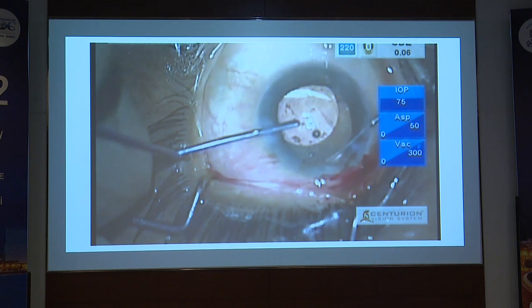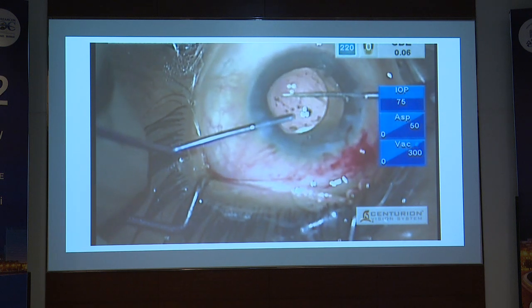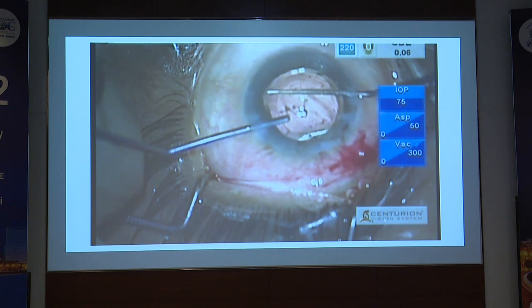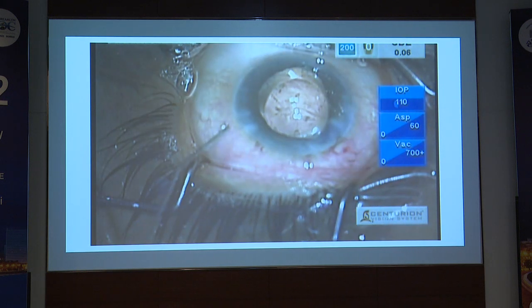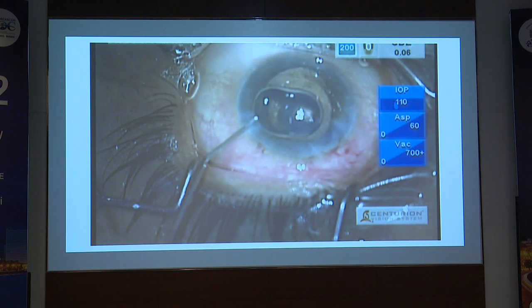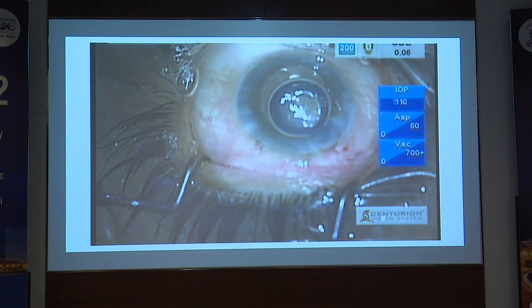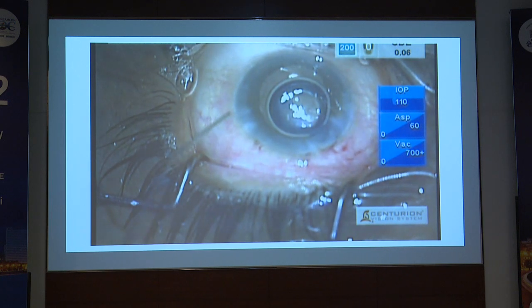In goes the IOL. So I waited to see everything is moving okay. Is the capsular bag stable, or will we have to put in an Ahmed segment? Mandatory air at the end of the case to see everything is good, no vitreous in the AC, and the case is over.